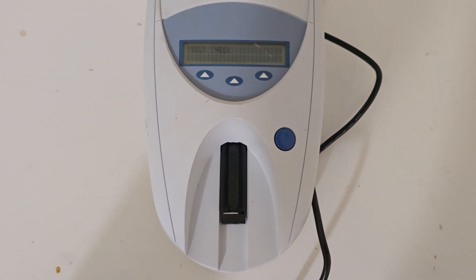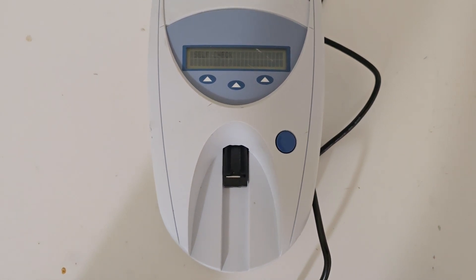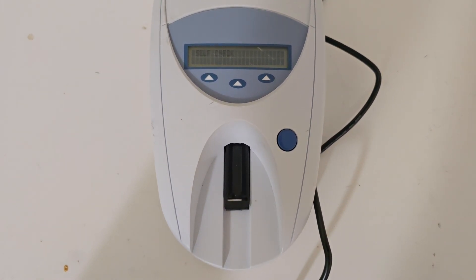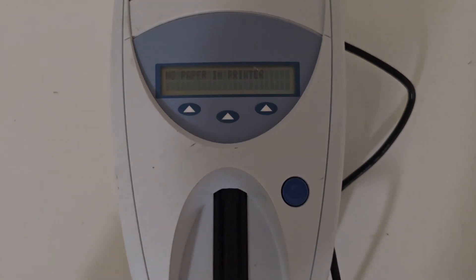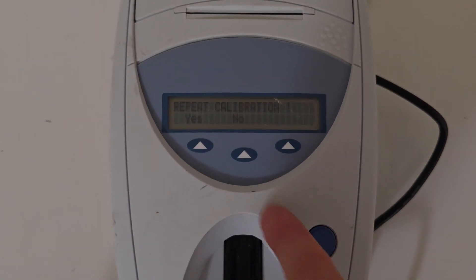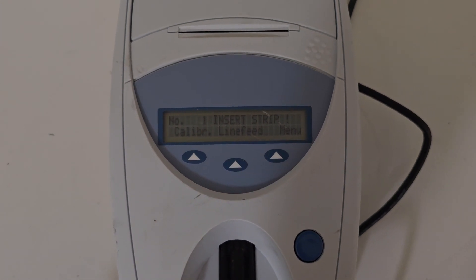Self-check. Okay, no paper in printer. Let me see — a few options: calibration. It's a strip. Okay.